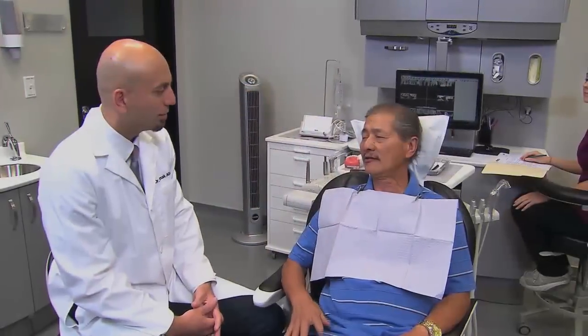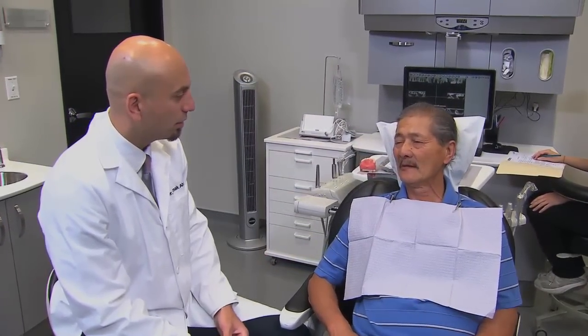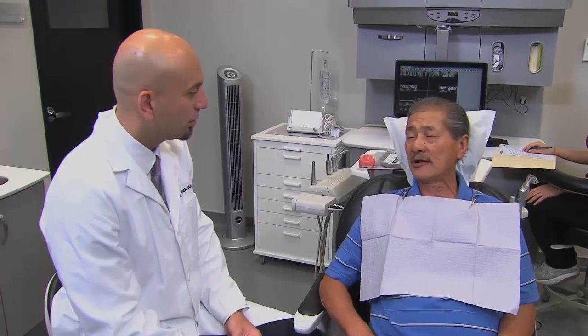This allows the doctor and patient to evaluate the shade and alignment at the try-in appointment. The dentist can then test the fit of the 3D printed base and confirm that it meets expectations before it's finalized. The doctor can confirm proper speech, function, alignment, and occlusal contacts, and the patient gets to make sure that they like the aesthetics of the design.